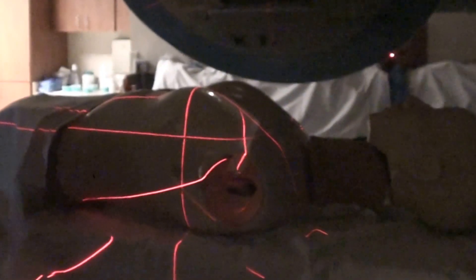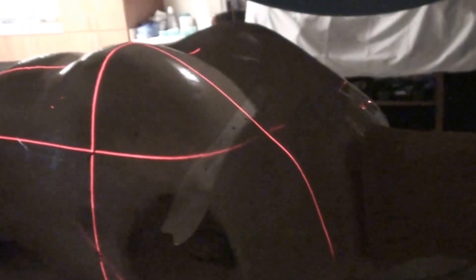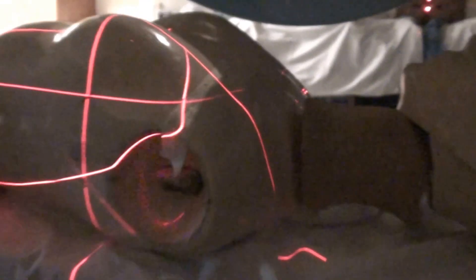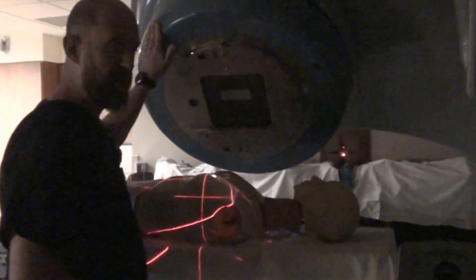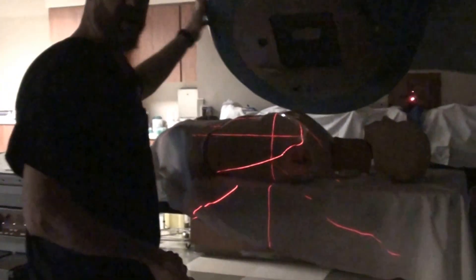We have our gantry set and our collimator is set in the proper position. Before we kick the table, we now see that there's an issue. Our match line and our diverging superior edge of the medial tangent do not match. Since we're at our medial tangent angle, we're going to kick the table — the feet of the patient — away from the gantry.